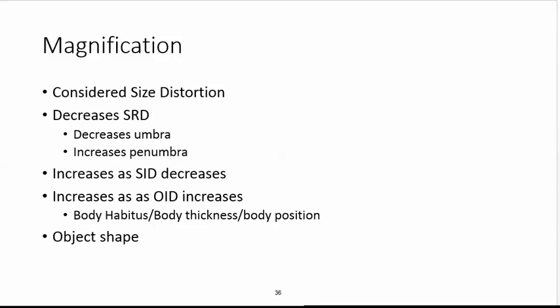If you remember back to last semester, we were talking about wrist bones, and we said that because of their shape, they're more narrow on the anterior surface than on the posterior surface. The anterior surface is what we usually put down, and we shoot a PA projection. That gives us the widest portion of the anatomy elevated off of the image receptor. And since it's elevated away from the image receptor, the OID of the posterior portion of the anatomy increases in size and increases its penumbra.